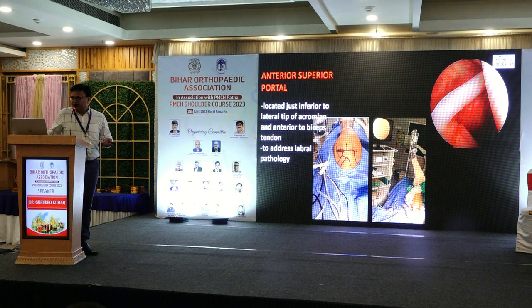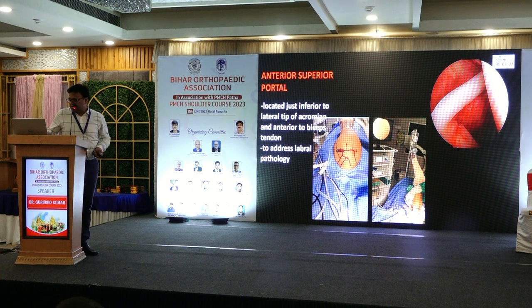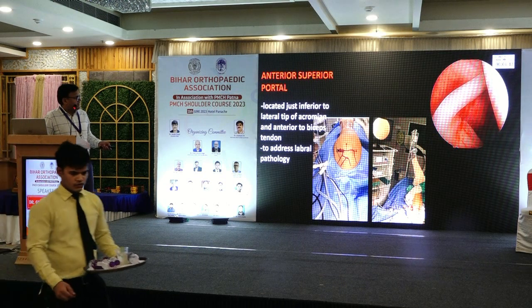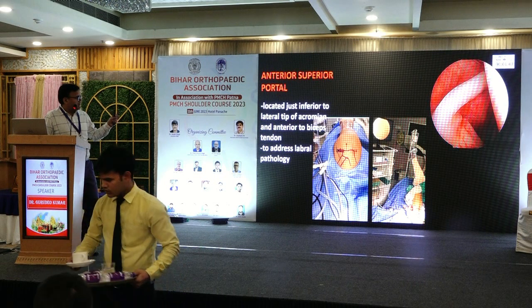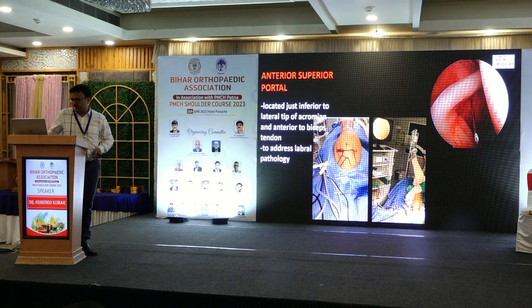The needle should pass directly anterior to the biceps tendon; otherwise it leads to crowding of the cannula. Take the spinal needle, and with the thumb or finger palpate the pulsation where we are going to introduce it; this is the site for the anterosuperior portal.